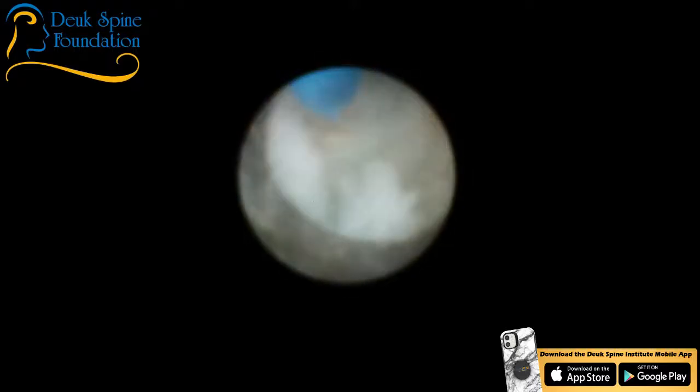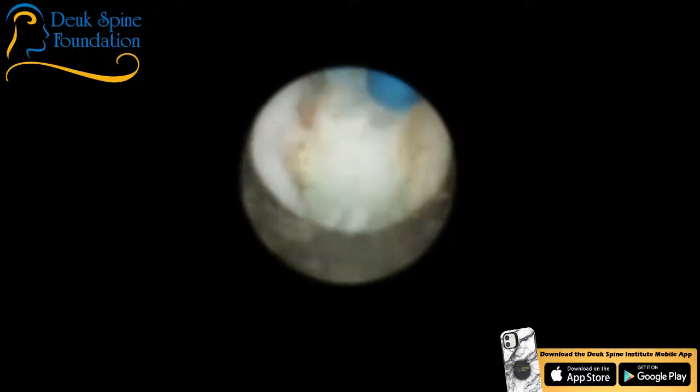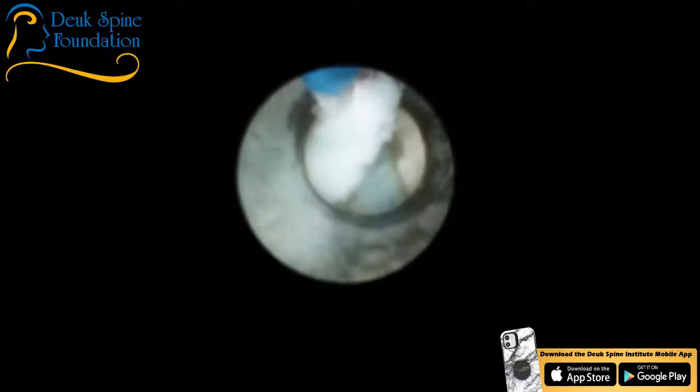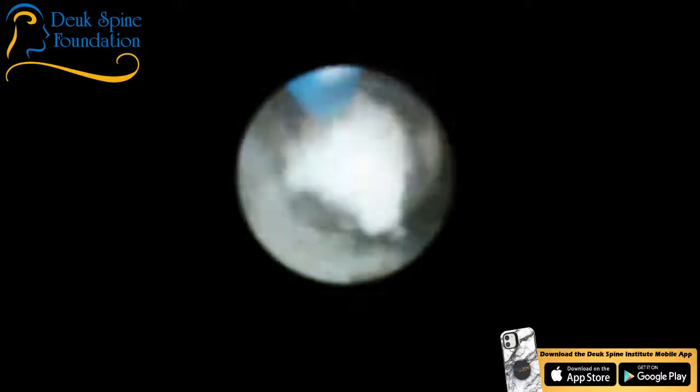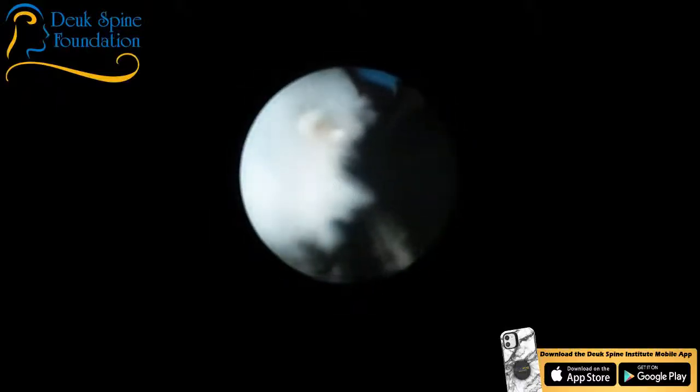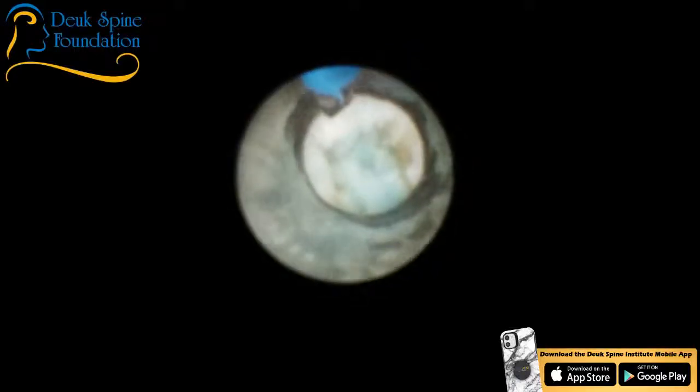So that was a pretty big herniation in the foramen. We haven't gotten all of it yet, but we've gotten a lot of it. There's another piece right there. Come on out, wiggly worm. All right. And these are herniations, fragments of nuclear material that broke off and went out through the annular tear, and they're sitting in the foramen.